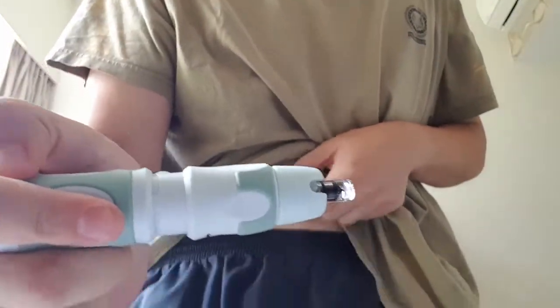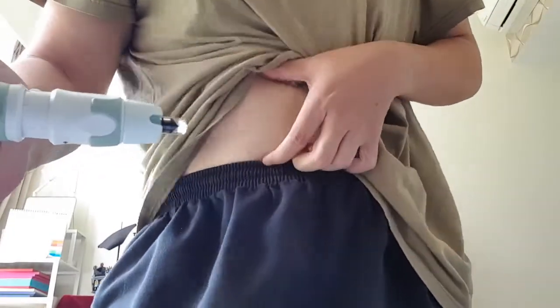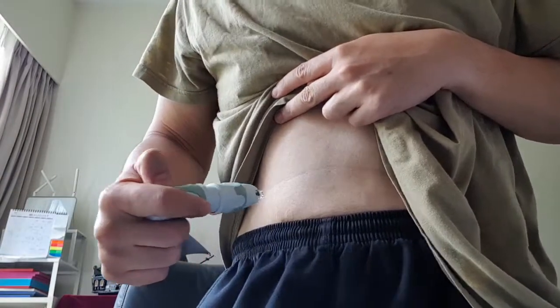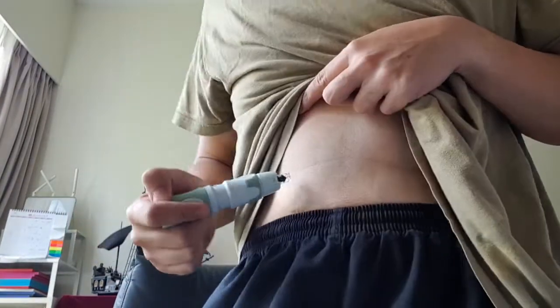So it's like holding a pen, literally holding a pen. The pressure — you don't need much pressure. I'll show you the injection. You just pinch a little bit, but the injection has to be perpendicular. You cannot slant it sideways.